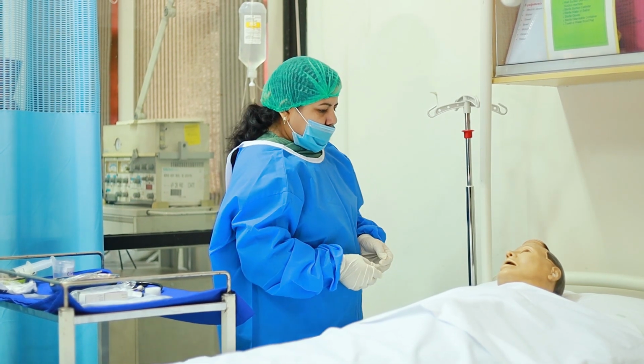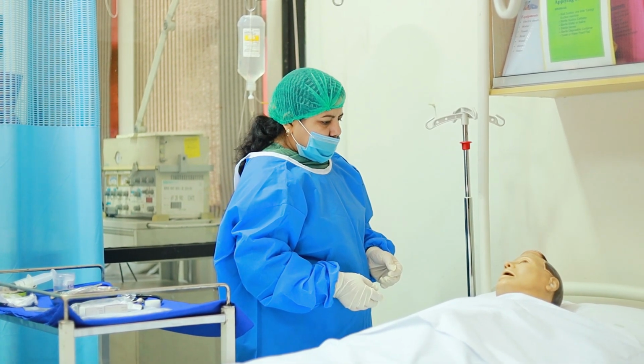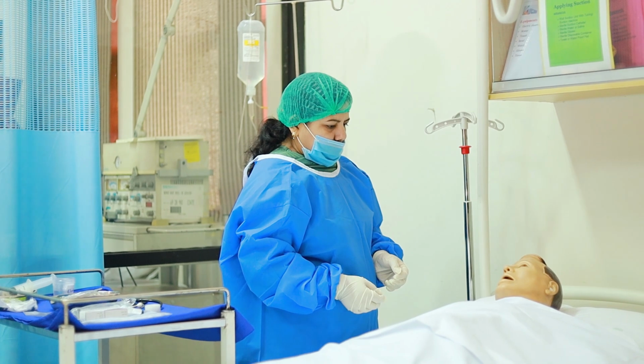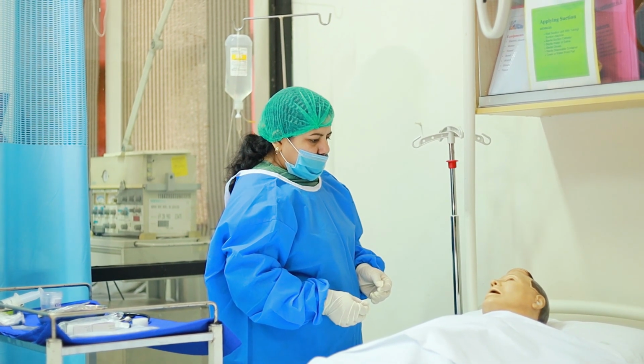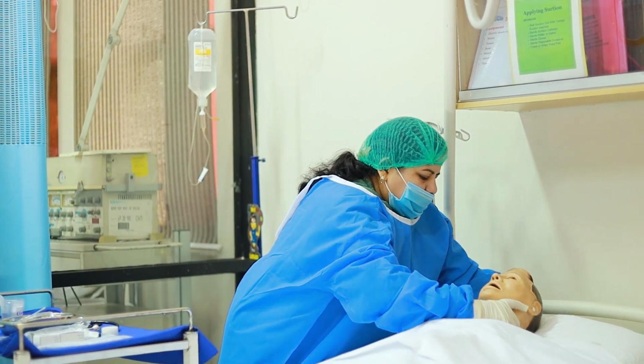Assalamu alaikum, Mr. Ali. How are you? Mr. Ali, I am going to insert an NG tube. So, do you allow me to pass the tube? Thank you very much. Mr. Ali, I am going to tilt your head.